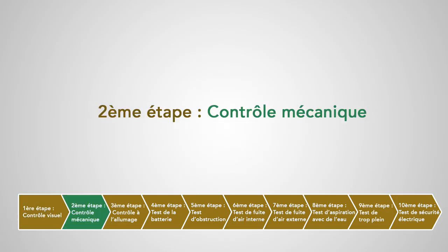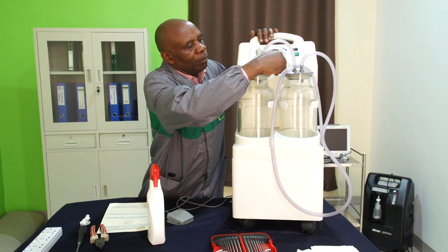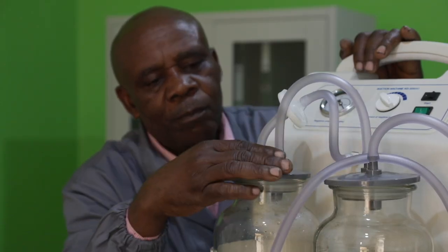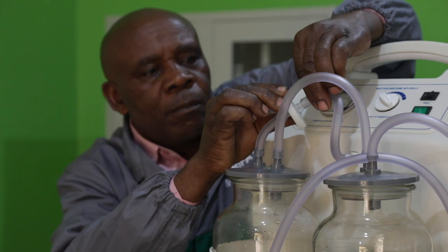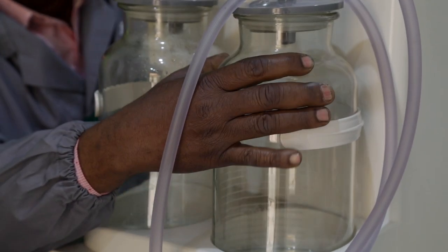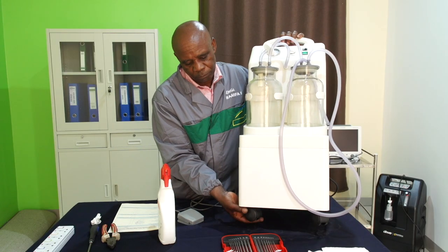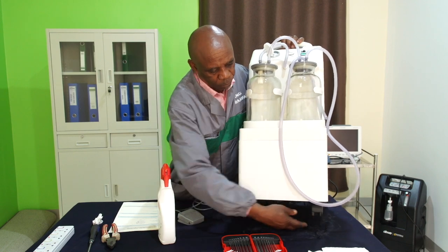Deuxième étape : contrôle mécanique. On va vérifier la fixation de la tubulure, du filtre, du couvercle et l'état du joint du bocal. On va vérifier l'état du support de l'aspirateur, la fixation du bocal sur le châssis, ainsi que les roues du chariot si notre aspirateur est monté sur un chariot.